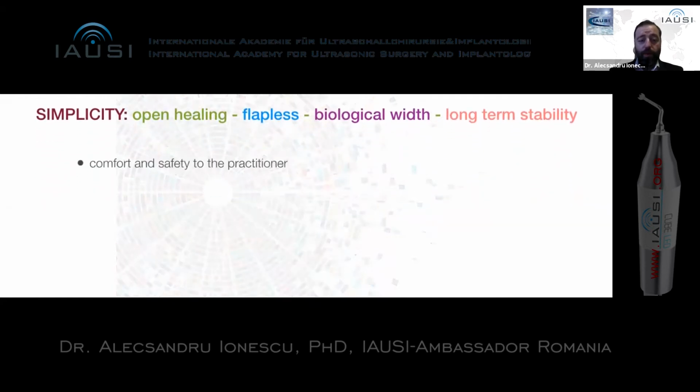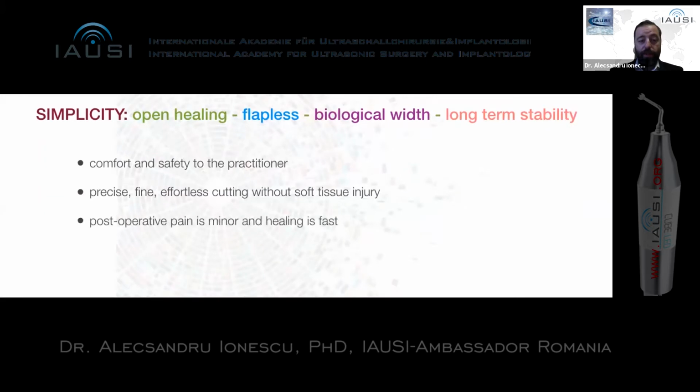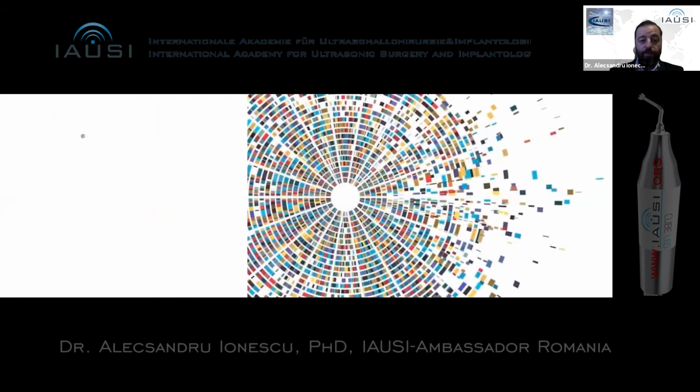So we can have a lot of comfort and safety using piezo. It's precise. We don't do any effort. And for the patient, it's very good in terms of post-operative pain. There is no pain and a lot less effort to obtain a cutting line, especially in the bone splitting of narrow crests. So when we do it also in a flapless approach, but this is part of another course.